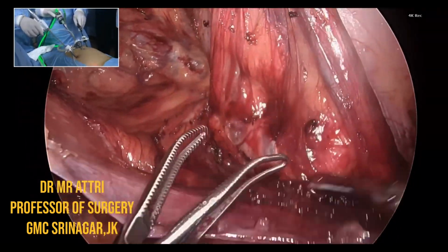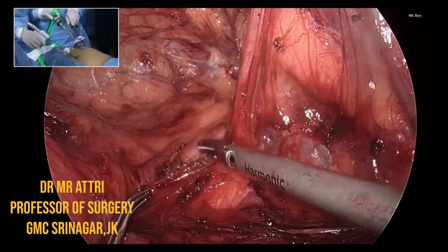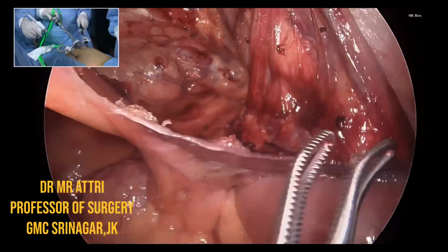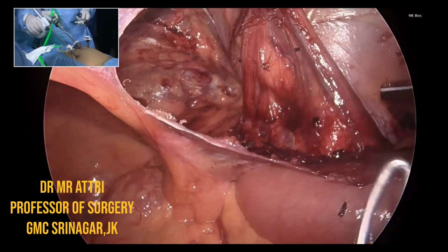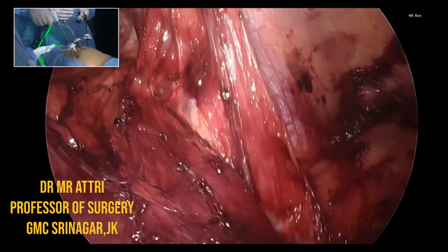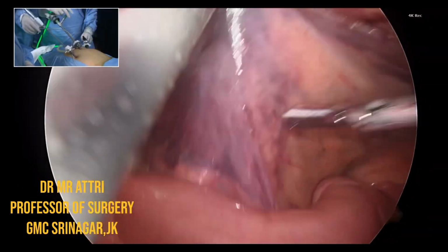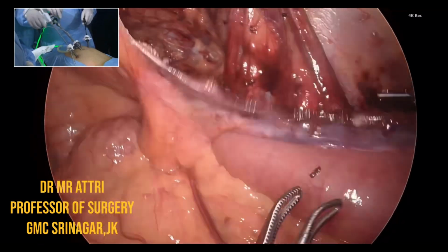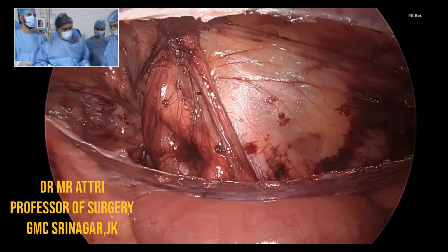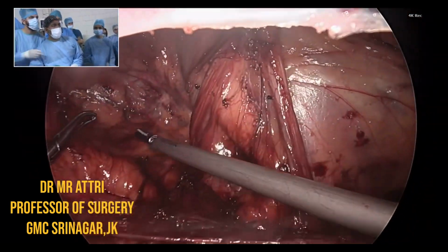हाँ, थोड़ा सा क्लीन करो बस, ये वाला फिनिश कर दीजिए. मैश 3D वाली थी ना, राइट साइड, टेक्सटाइल एंड राइट. आप उठा के देखो, हाँ ठीक है, शिफ्ट करो ऑडियो से, हमें मैच डालनी है यहाँ पे.